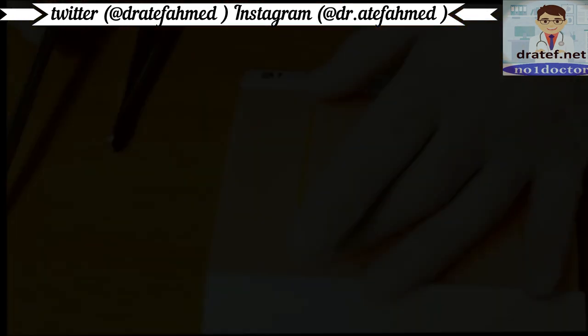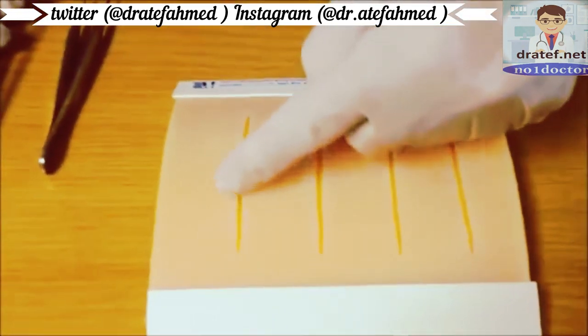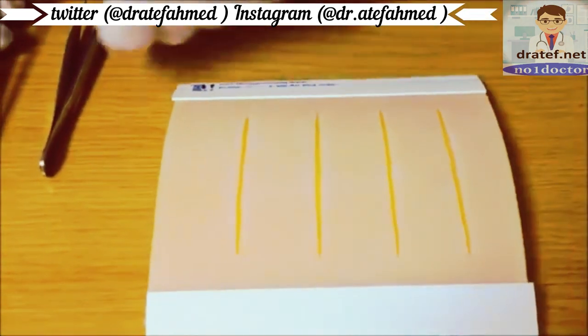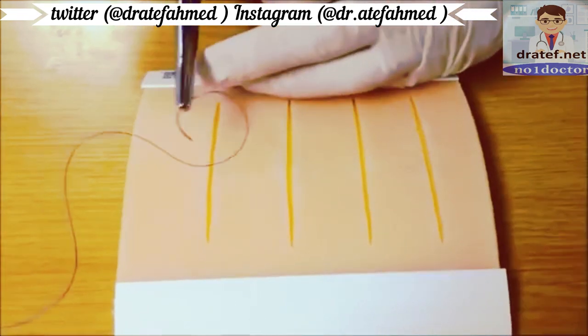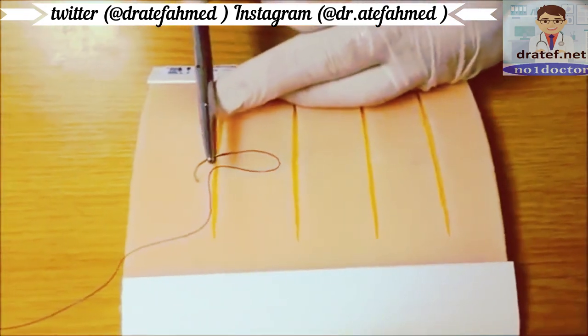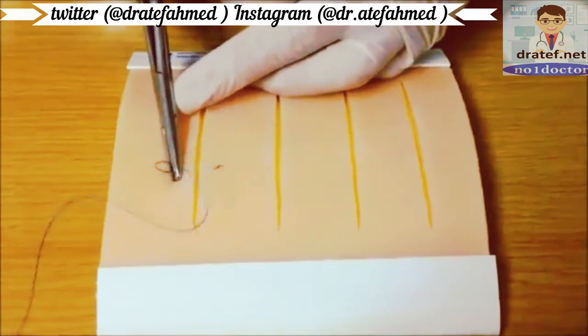When suturing a wound, we suggest starting in the middle and then progressively halving the gaps in between to ensure even distribution of sutures. For a simple interrupted suture, insert the needle at 90 degrees to the skin and with a rotating motion of the wrist, simply twist the needle through.